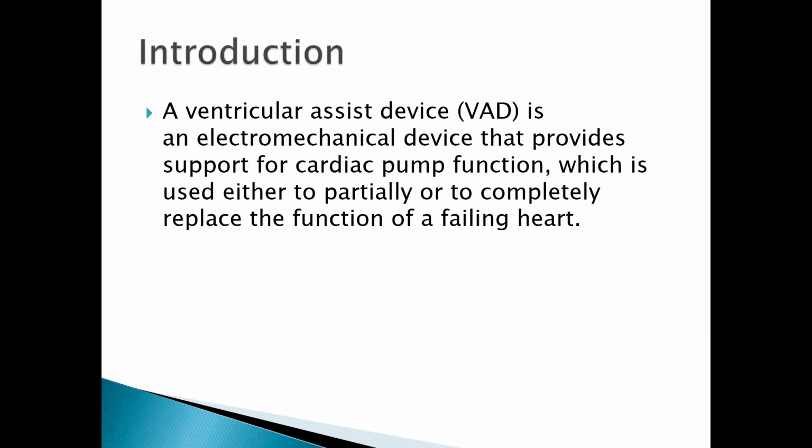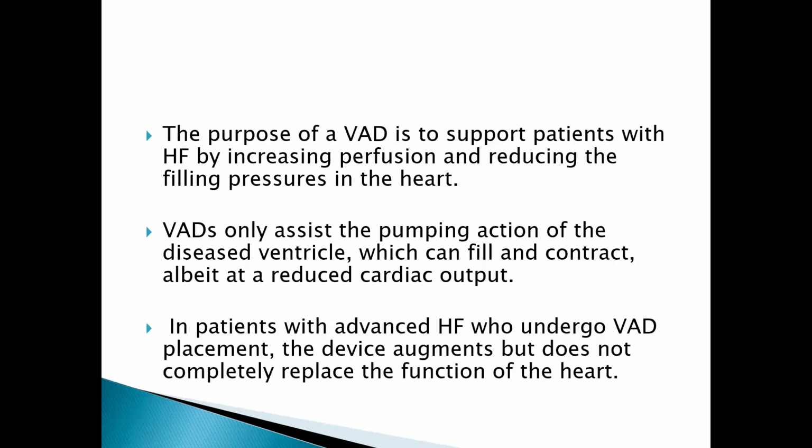I'll start by saying that a ventricular assist device is an electromechanical device that helps to support cardiac function. Normally, these pumps can partially or completely replace the function of a failing heart. We're talking about a ventricular assist device as a support mechanism for a heart that is already failing. The purpose is to support patients with heart failure by increasing perfusion and reducing the filling pressures in the heart. These devices assist the pumping action of the diseased ventricle.